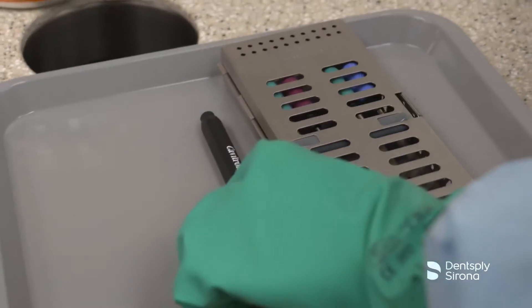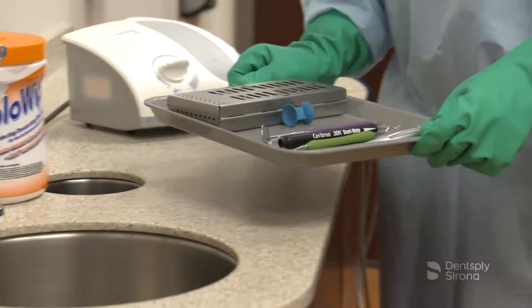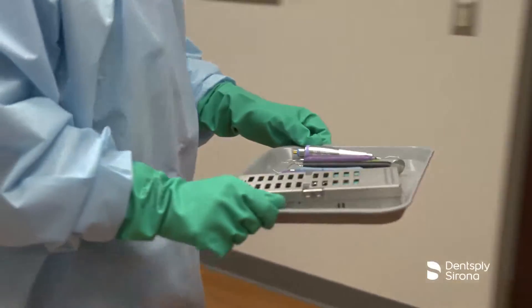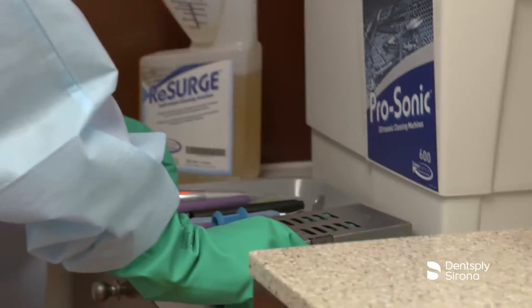Contaminated instruments should be transported in instrument cassettes, trays with sides, or labeled containers with lids when cassettes are not an option. Occupational safety must be followed by clinicians to reduce the risk of sharps injuries and exposure to contaminated instruments.